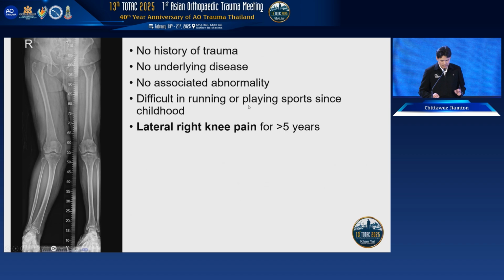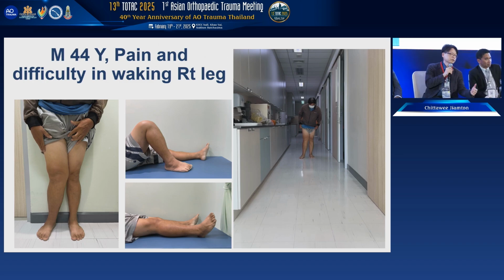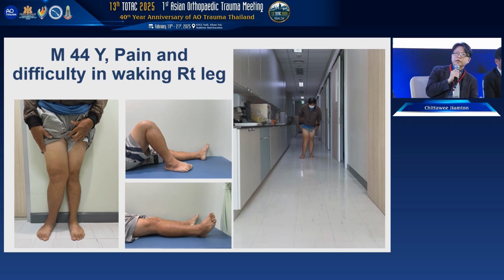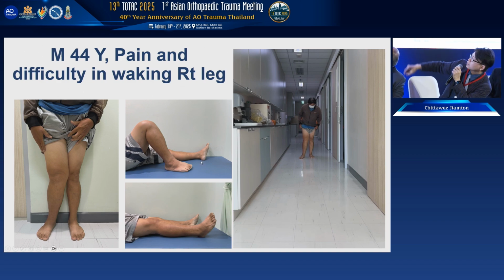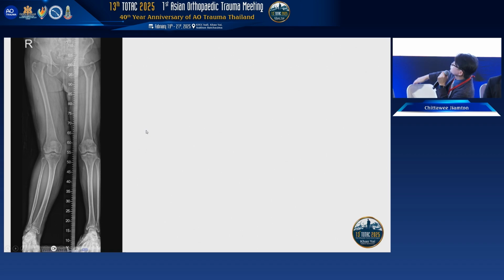Okay, any concern about the appearance of the patient? Yeah, I think this is a deformity from a different pathogenesis, not trauma. And unilateral overgrowth could be either idiopathic, or from intramuscular hemangioma, or from neurofibromatosis. I noticed that there is some spot, maybe a café-au-lait spot, over the thigh. You can see it on the first X-ray, in the soft tissue.